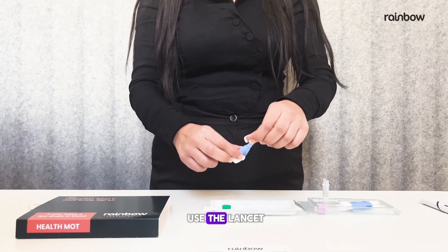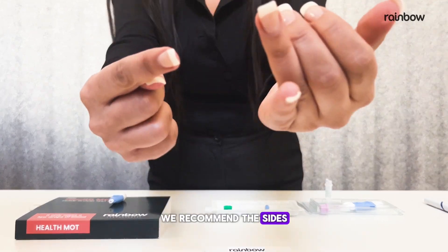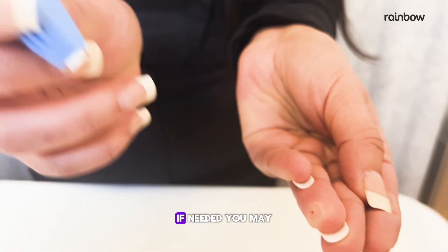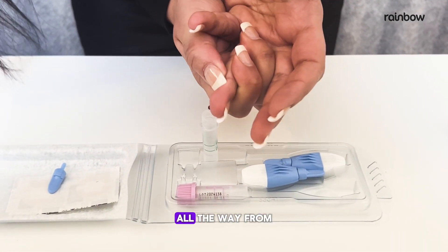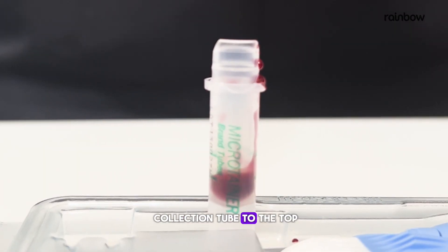Now it's time to use the lancet. Twist off the blue stick. We recommend the sides of your middle or ring fingers — press the lancet firmly against your finger until you hear a click. If needed, you may use another lancet to ensure you have enough blood. Gently massage your finger all the way from your knuckles to form the drops and fill the blood collection tube to the top.